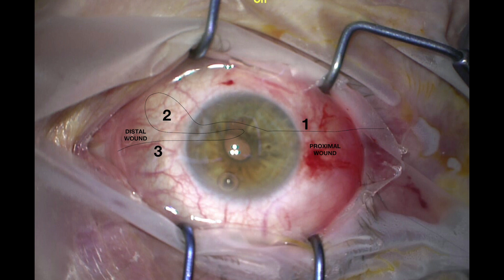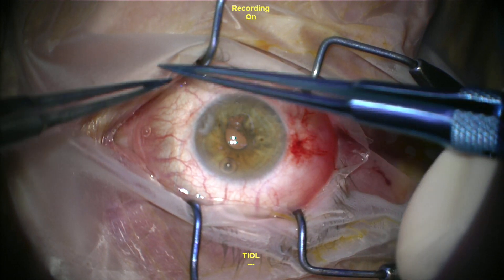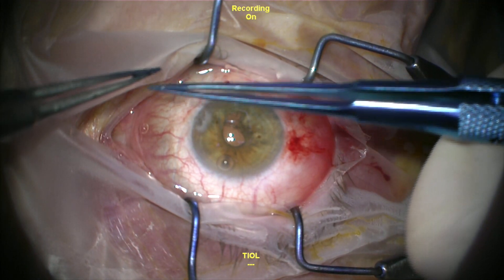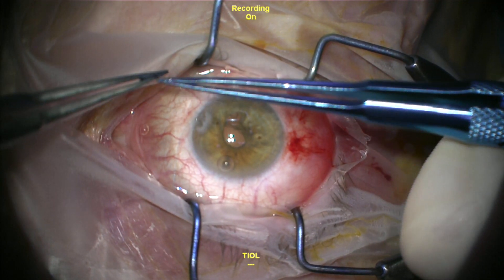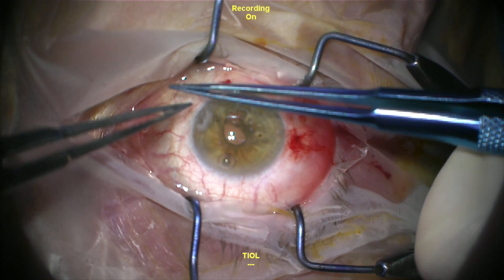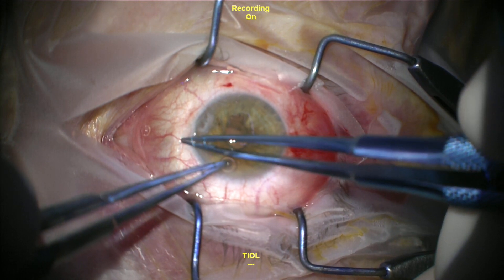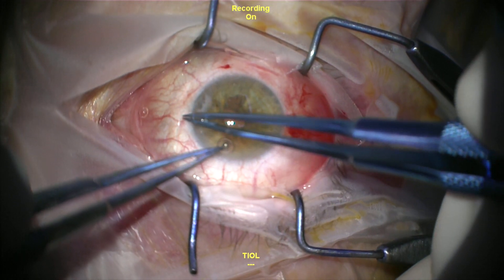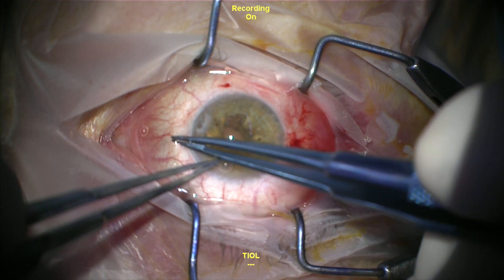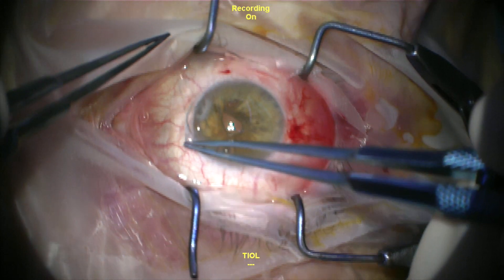Now we start the first part of the 3-1-1 suture. It's really important not to over-complicate this in your mind. Start by putting your tying forceps inside the loop labeled number two, then do three loops around your tying forceps and carefully go and grab part three of the suture with your tying forceps.